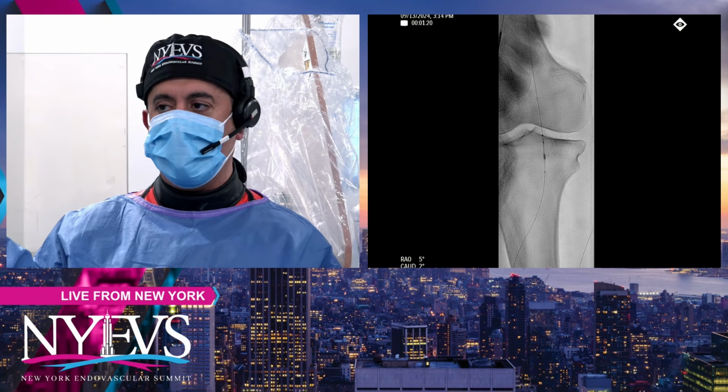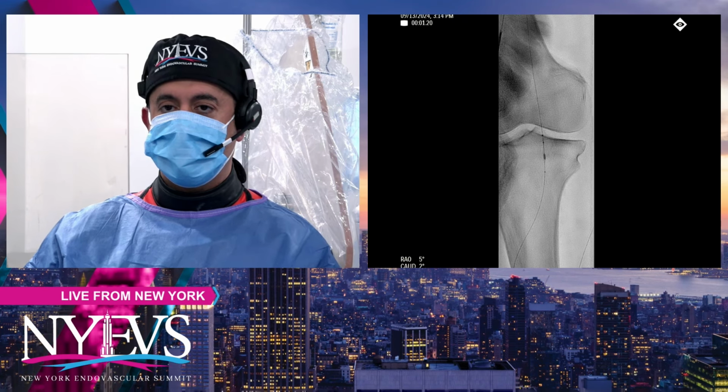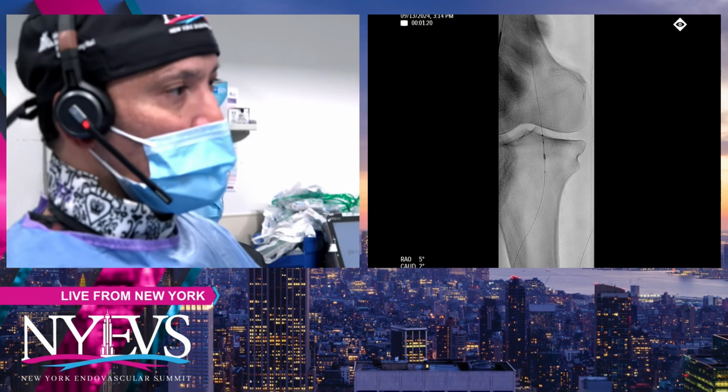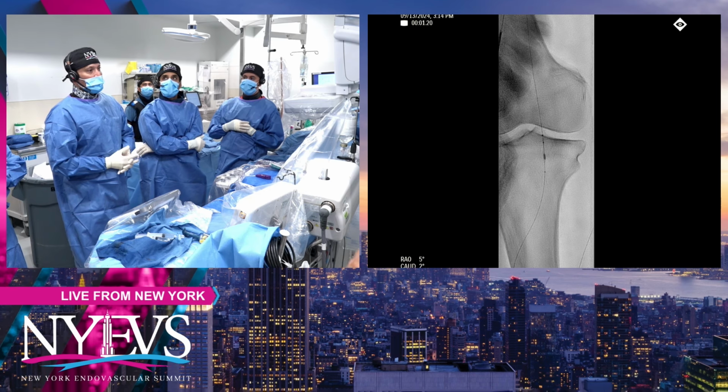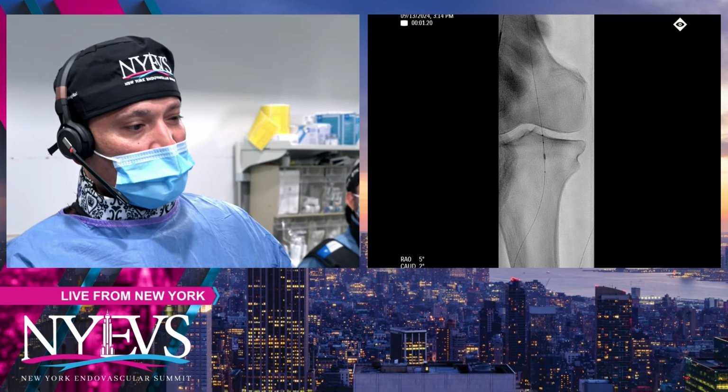I think we are confident enough that we'll be okay by the time we get done. I think the main thing though, George, I don't think we took it for support sake. There was a lot of wire bias into the stents. We just wanted to take the bias out. That's why we used the balloon to track for us to track it.